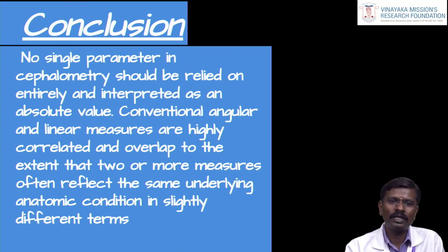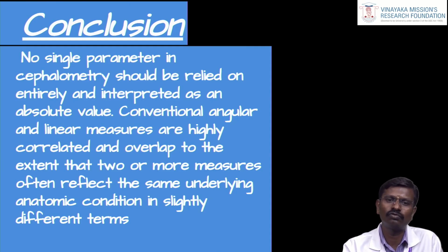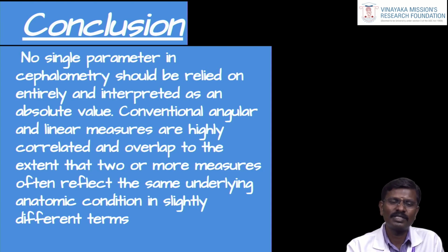So if you read all the analyses, you will come to know, for your case specifically, if you want to find out whether the problem is in the vertical position of the incisors or the vertical position of the molars, or whether the molar had moved forward or backward. Like this, each analysis has specific landmark identifications. So if you are interested, you can read all the analyses and make out specific readings separately, and you can put them together as one analysis. It's called a composite analysis.